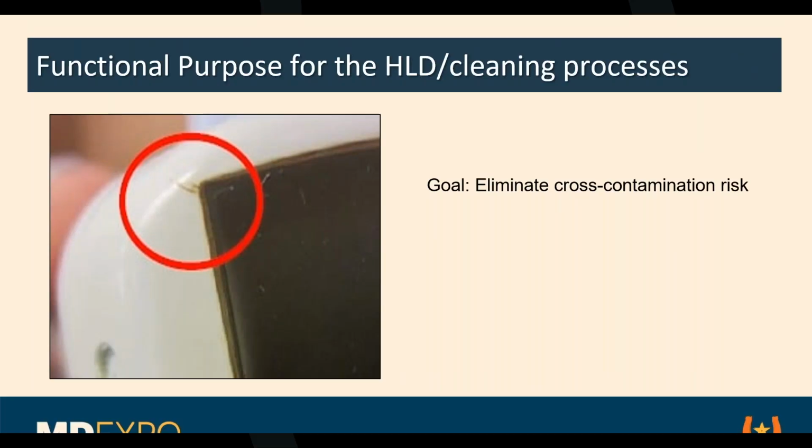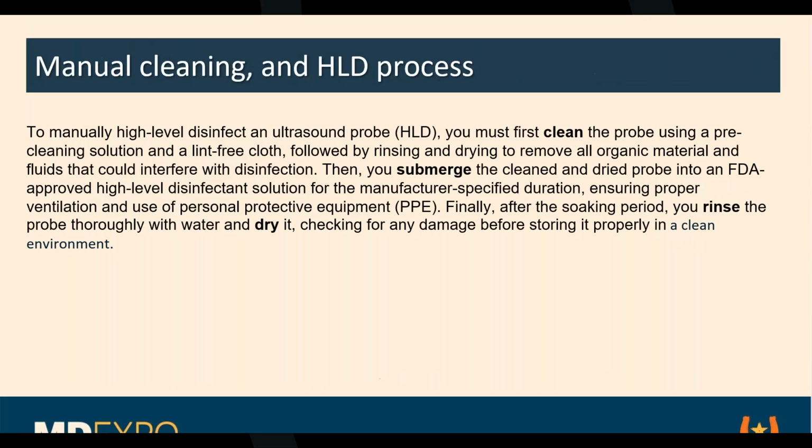So look around these places, because that looks like a real small cut, but you can pack a couple billion germs in there, no problem. And that's a cross-contamination issue.